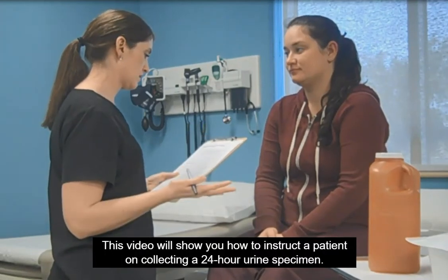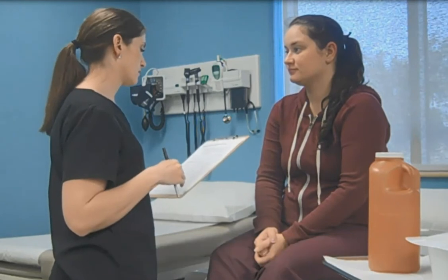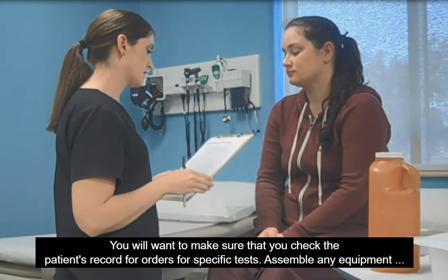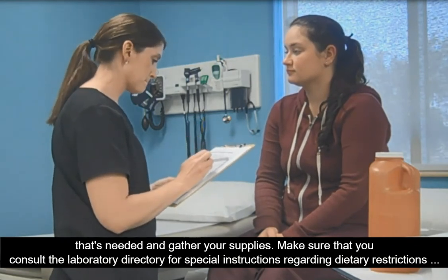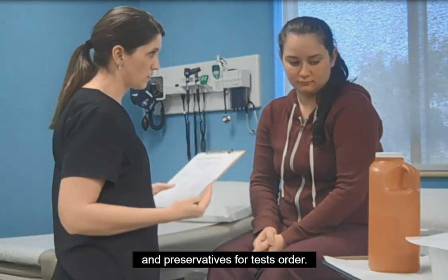This video will show you how to instruct a patient on collecting a 24-hour urine specimen. You will want to make sure that you check the patient's record for orders for specific tests, assemble any equipment that's needed, and gather your supplies. Make sure that you consult the laboratory directory for special instructions regarding dietary restrictions and preservatives for the test ordered.